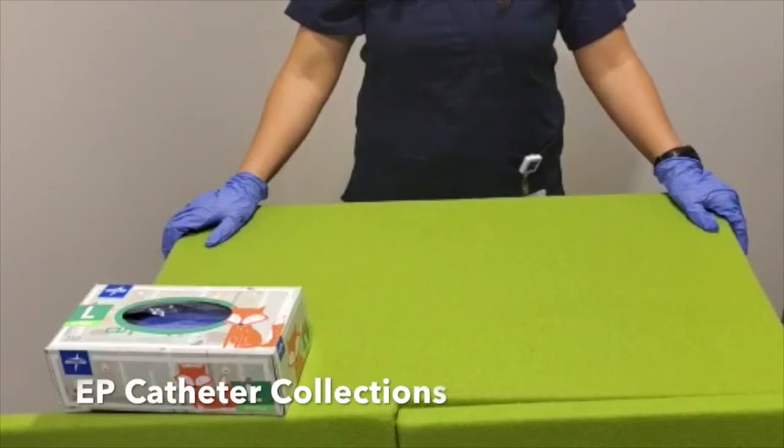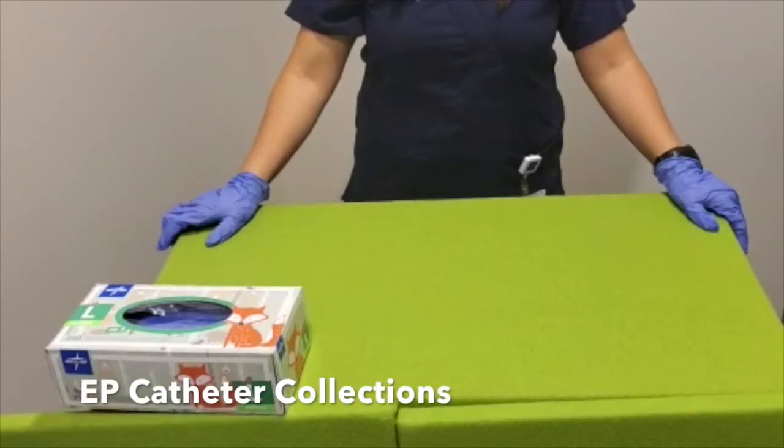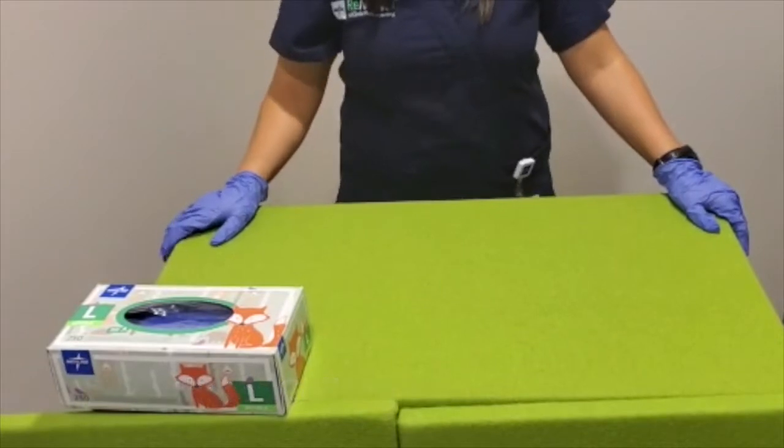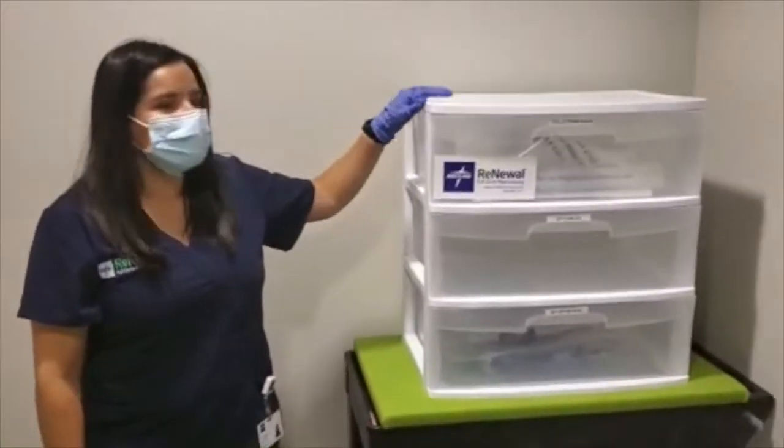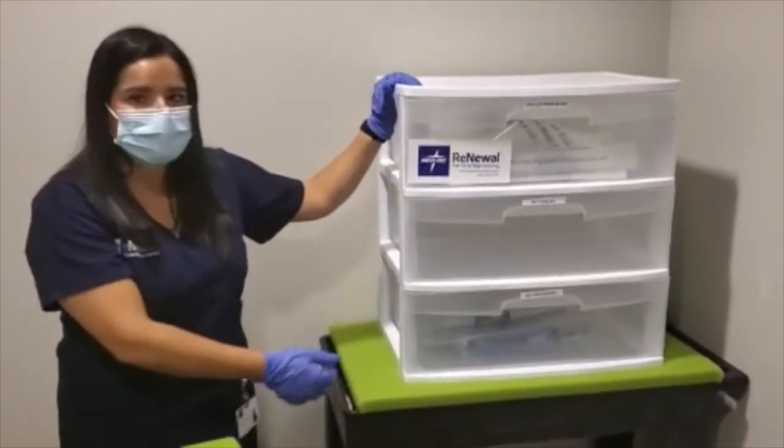Today we're going to be focusing on shipping and collecting EP catheters. Wearing the appropriate PPE, go to the collection area. You would generally find collections in a drawer system like this.